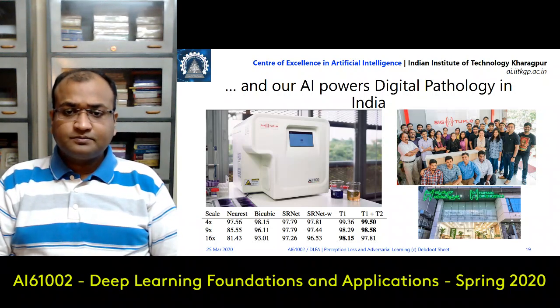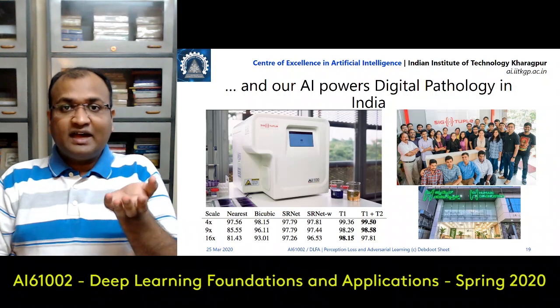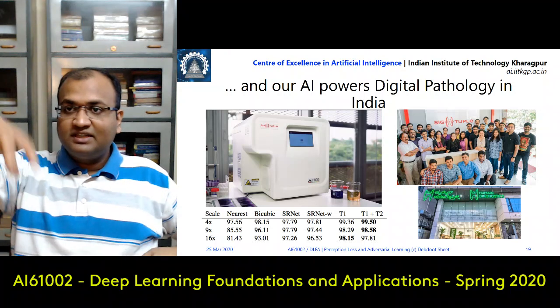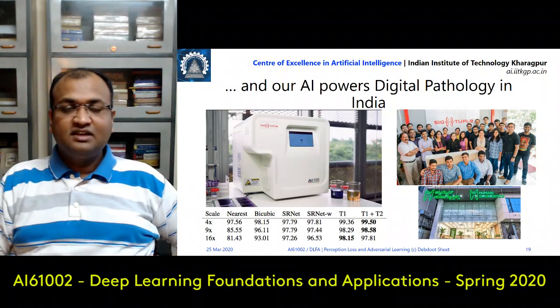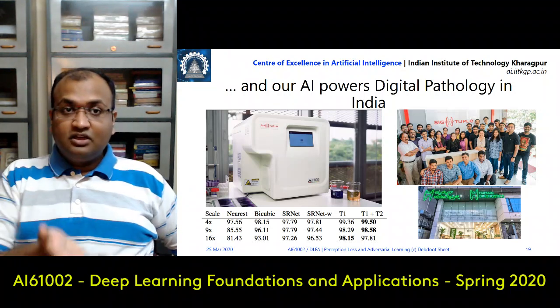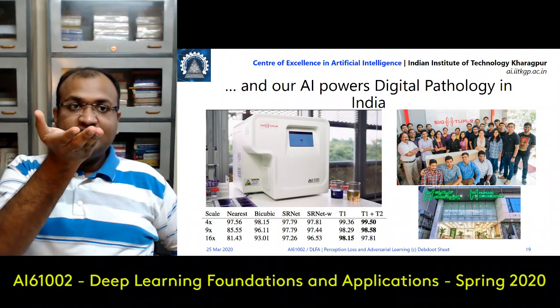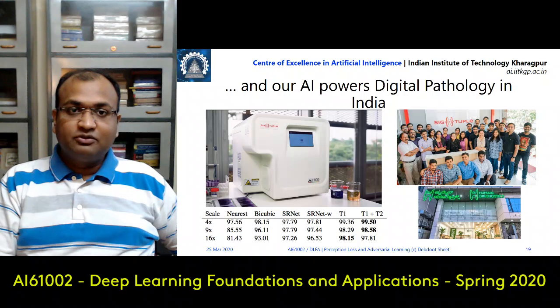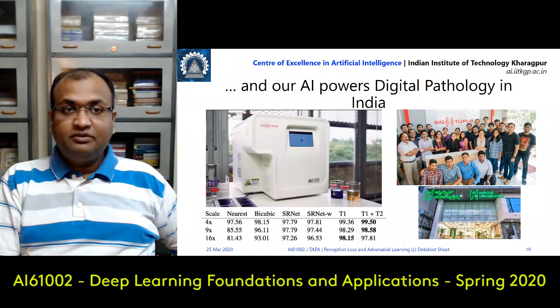So now, if you actually image that slide at 40x and you acquire it, you find out that these many are over here and these locations have these classifications. Now if I scale up from 10x to 40x and give this image to the AI engine and ask it to find them, then what is the performance, or what is the total concurrence between these two findings?